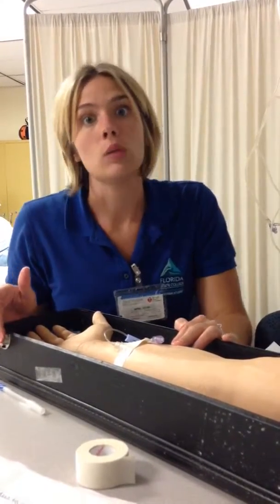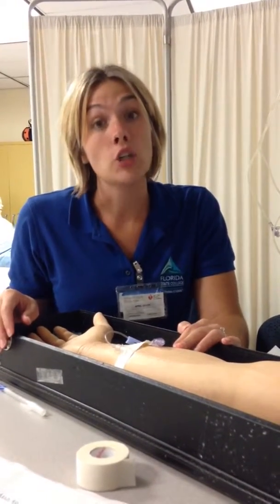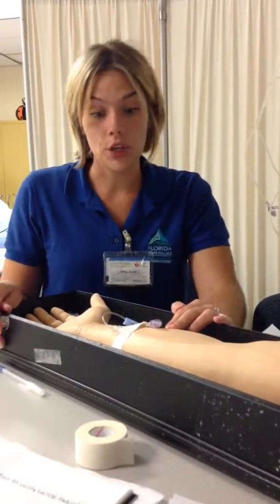So he has received approximately 102 mLs of normal saline mixed with 2 mLs of blood return, and Flagyl, which is 500 milligrams to fight an infection. IV medication administration. As I'm pushing that last little 3 milliliters.